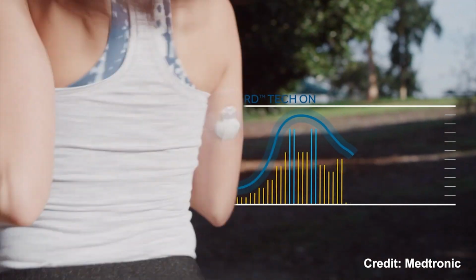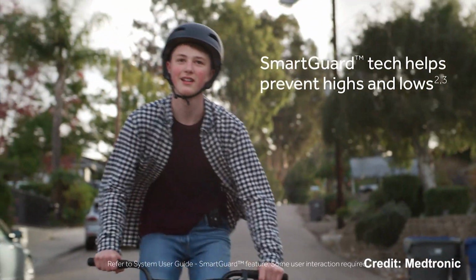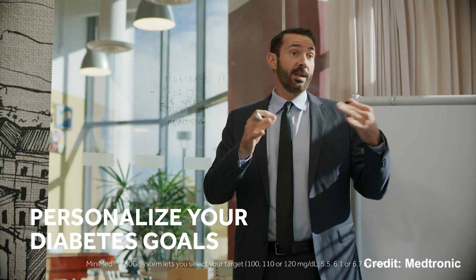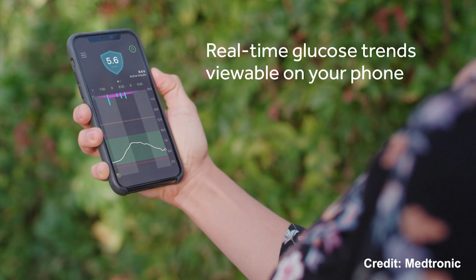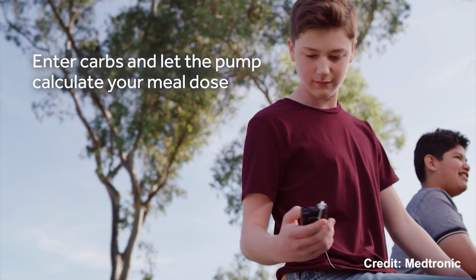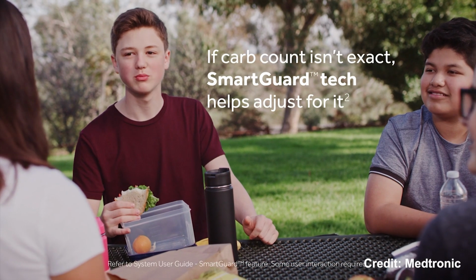670G's goal was set at 6.7, but the brand new 780G has a customizable target which can be set as low as 5.5 or 100 milligrams per deciliter. Beyond this, 780G is now a Bluetooth-based system, and it comes with a companion Android and iOS app where users can see all of the glucose data, insulin data, alarms, as well as alerts. Remote bolus is not possible here. Data is for viewing only.